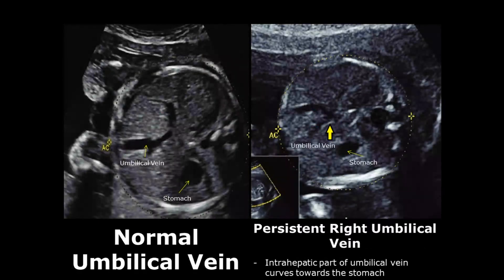A persistent right umbilical vein occurs when the intra-hepatic component of the umbilical vein curves towards the stomach instead of curving to the right side. Here you can see the umbilical vein curving towards the right side, and over here it is curving towards the left side towards the stomach.